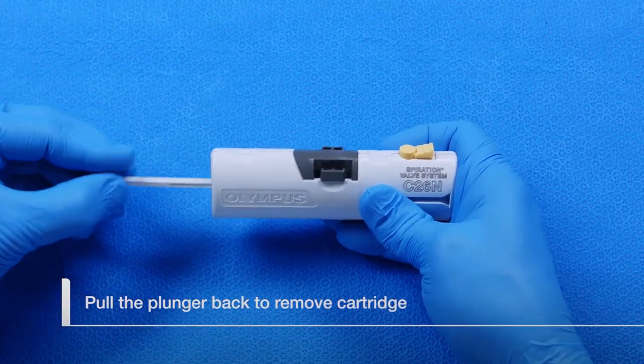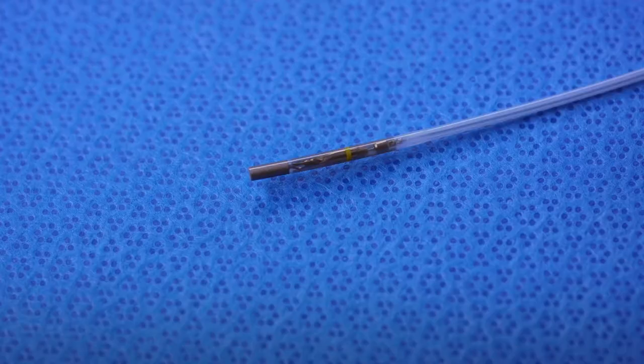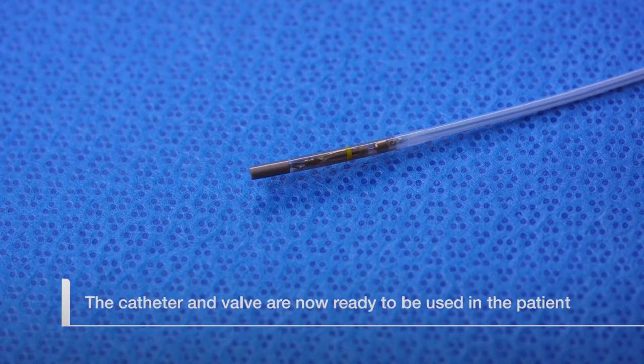Pull the loader plunger all the way back and remove the cartridge. The catheter and valve are now ready to be used in the patient.